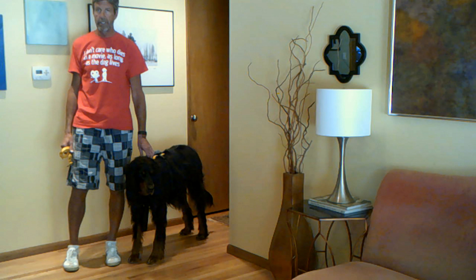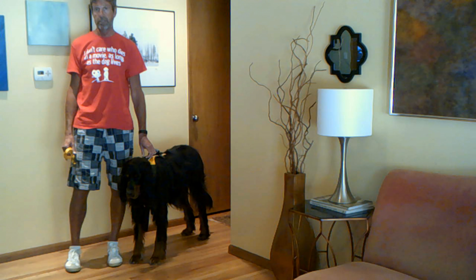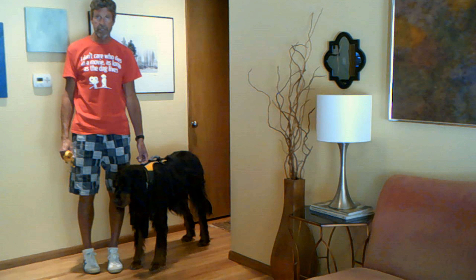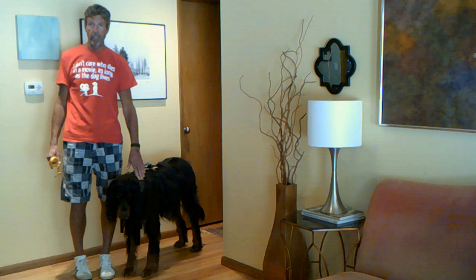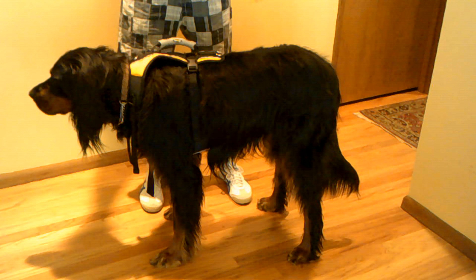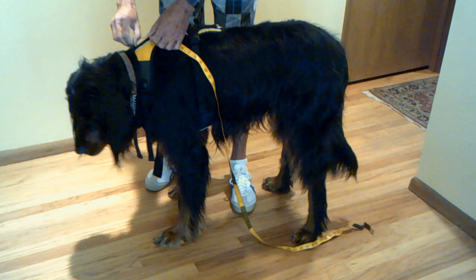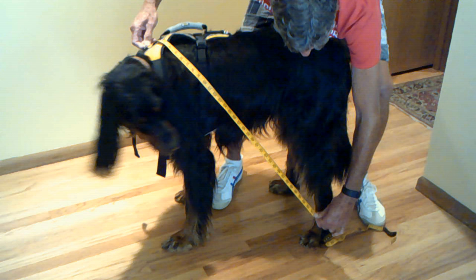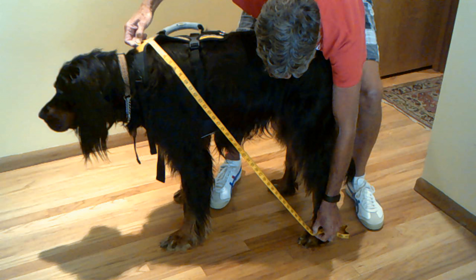First we're going to do the measurement for the shock cord. If you have a harness, you'll want to measure from the D-ring up towards the top of the harness. Brody is wearing the Help Em Up harness today without the implant portion. So we're going to measure from the D-ring down to his back paw, and for Brody it comes to 40 inches.